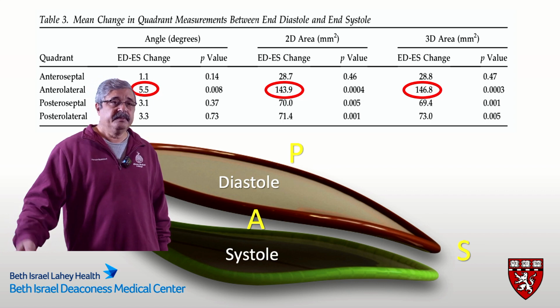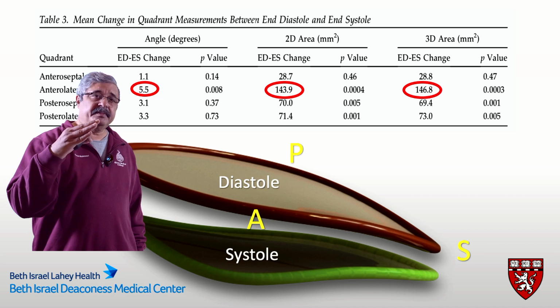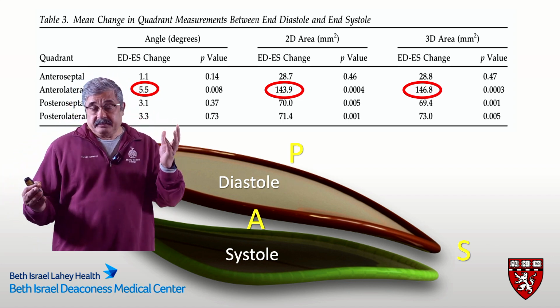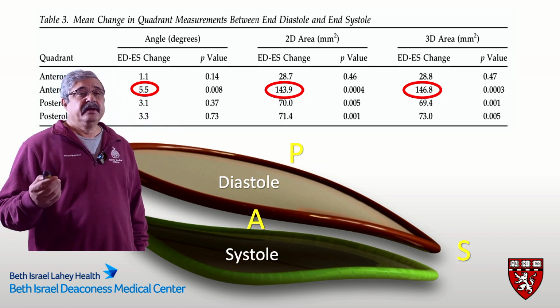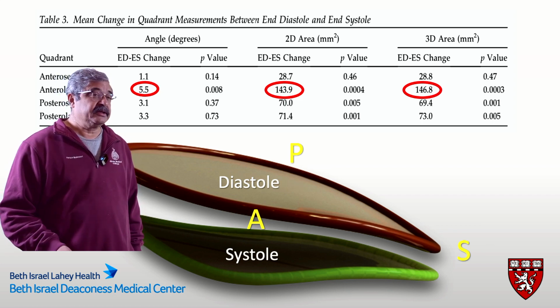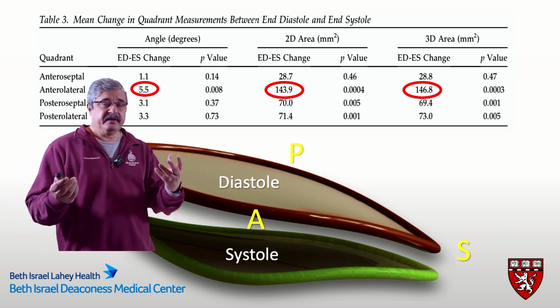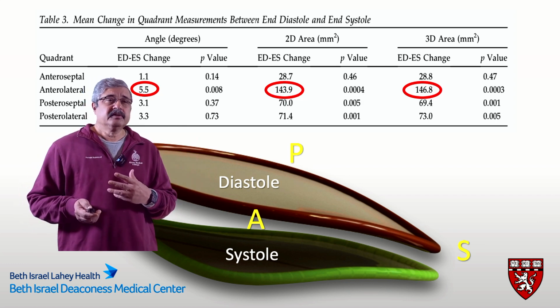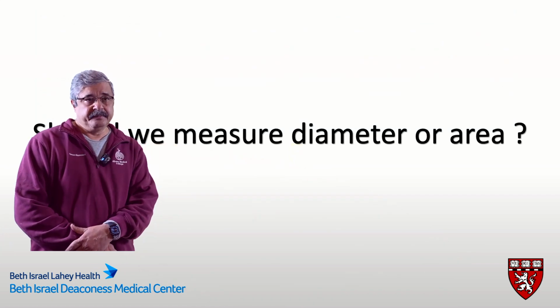We actually even 3D printed the tricuspid annulus, as you can see in this graphic, and put them in the exact shape on the same patient to see, was there any predictability in all these patients that we did that? So lo and behold, there was none. So this was a very sophisticated study to demonstrate the lack of a predictable behavior of the tricuspid valve when it relates to axial change in diameters, with a heterogeneous behavior in its quadrant changes, and we came to the conclusion that it was more prudent to measure the tricuspid annular area as opposed to a specific diameter.